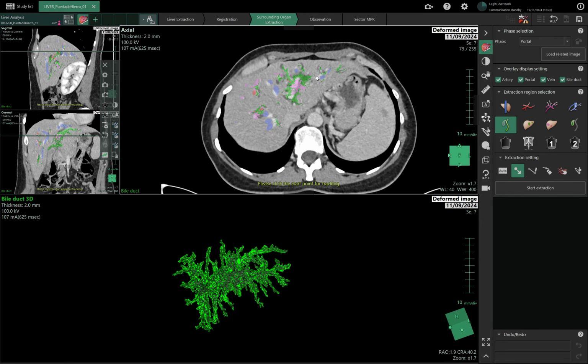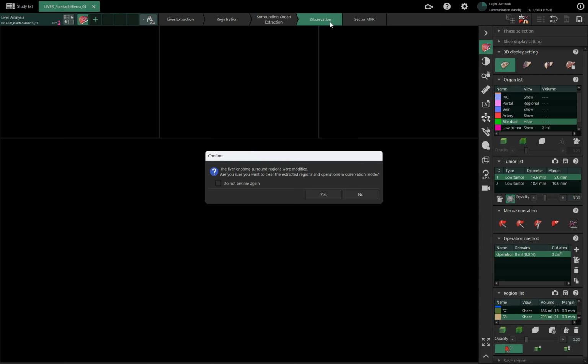The structures of the vessels, the anatomical variations, mostly everything that will be extracted is at least good information for doctors. 100% secure, I will never say that in front of the doctor, but inside this meeting room, I will tell you that they are really great extractions.